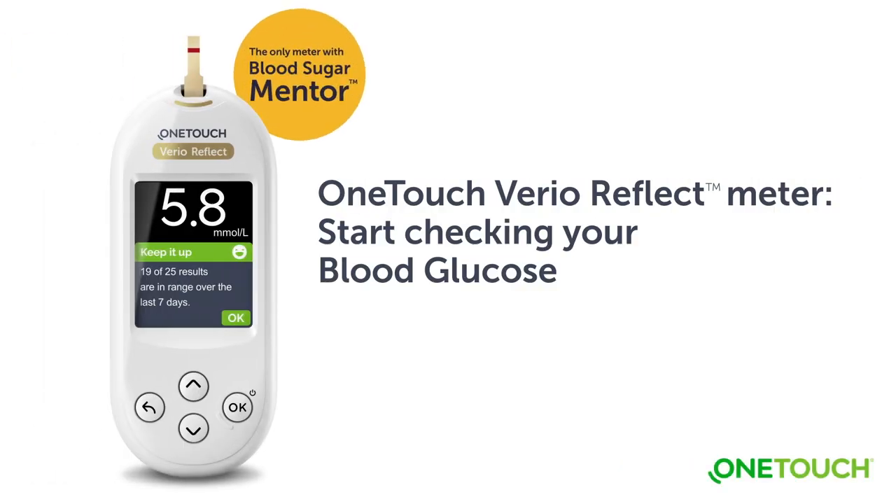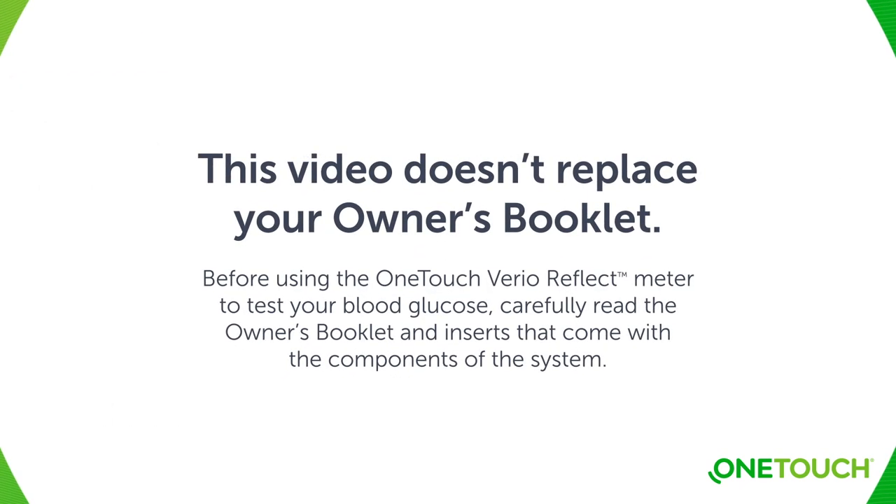Start checking your blood glucose with the OneTouch VarioReflect meter. This video doesn't replace your owner's booklet. Before using the OneTouch VarioReflect meter to test your blood glucose, carefully read the owner's booklet and inserts that come with the components of the system.